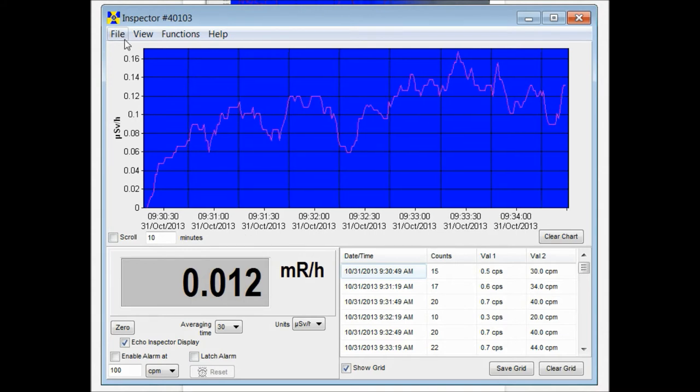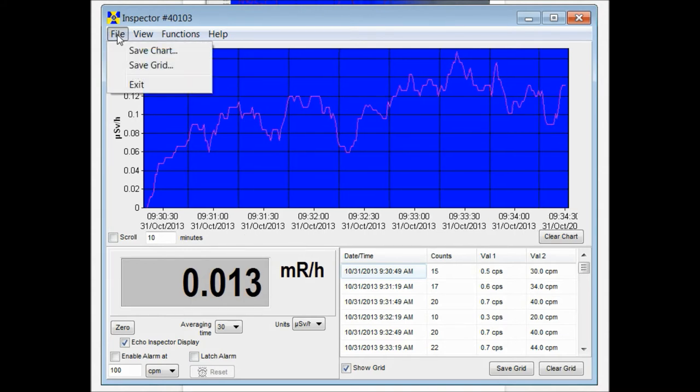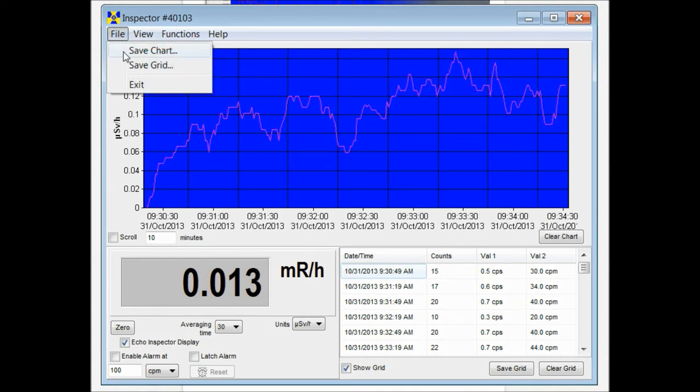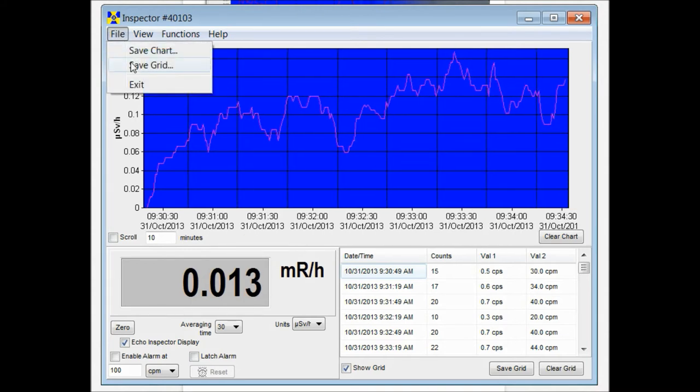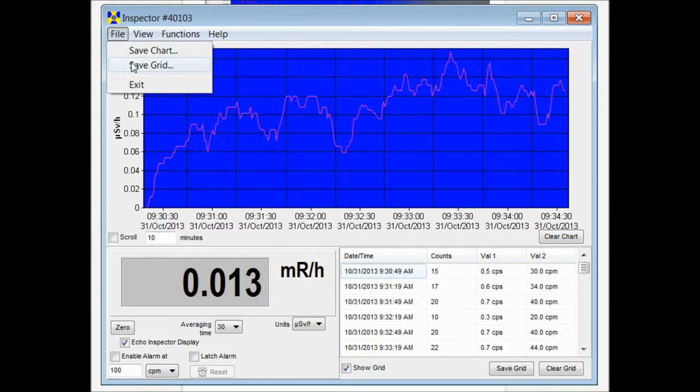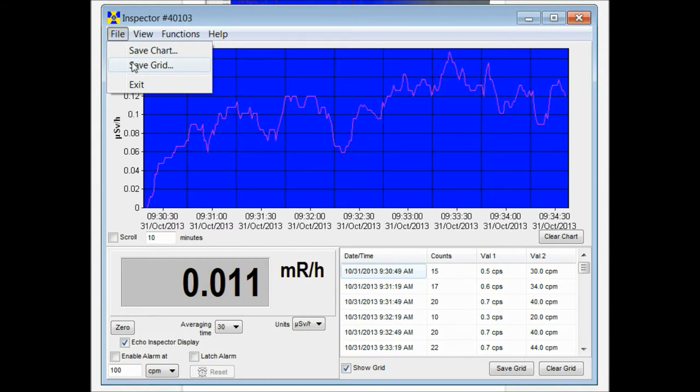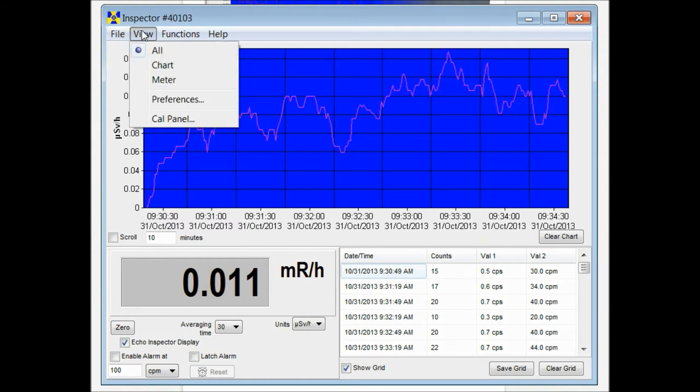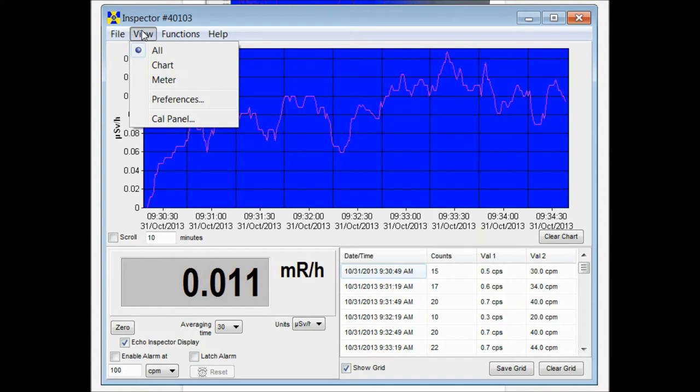It puts a little stamp on there so that when you go to save it, you can save the chart or the grid and it saves it in a comma delimited text file that you can open up in any spreadsheet software.